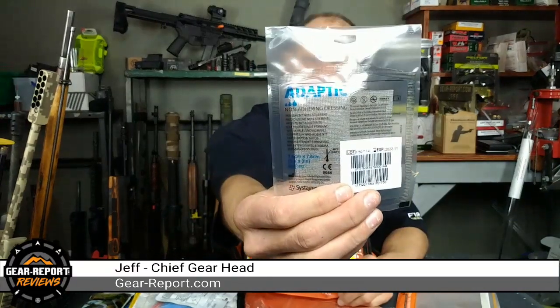All right, we got some safety pins here, a set of tweezers, a pencil. This is important in emergencies, especially things like putting a tourniquet on. You need to note the time that it was put on, because that's going to be important to the medical professionals that are trying to save that limb once the person's been stabilized. Adaptic non-adhering dressing. I'll be honest with you, I don't know what this one's for. I'm going to have to go read about it and understand what that is, so that should I ever need to use it, I know how to use it.